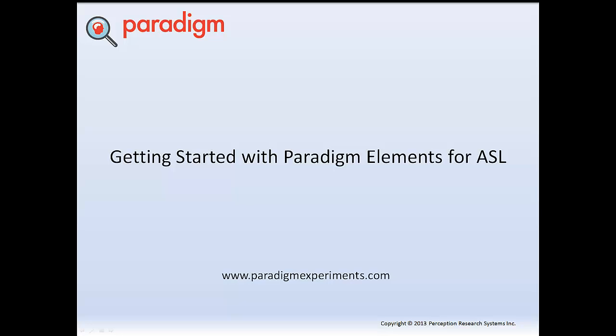Welcome to this introduction to Paradigm Elements for ASL. In this tutorial, you'll learn how to integrate a simple choice experiment with your ASL eye tracker.